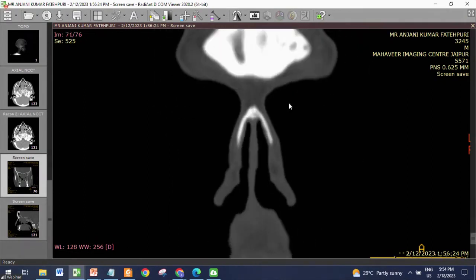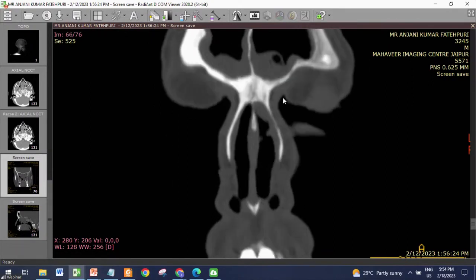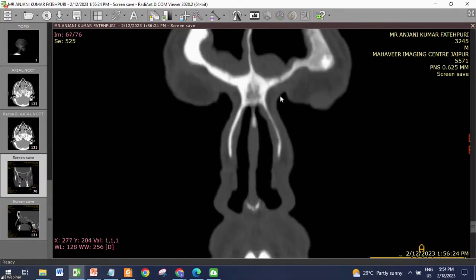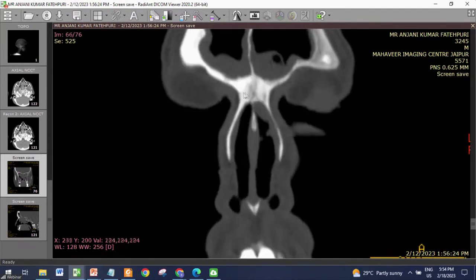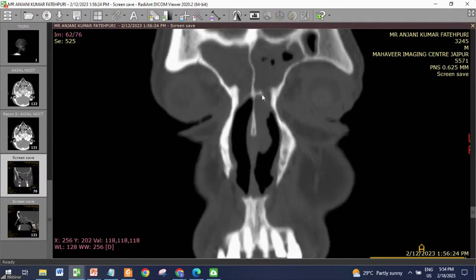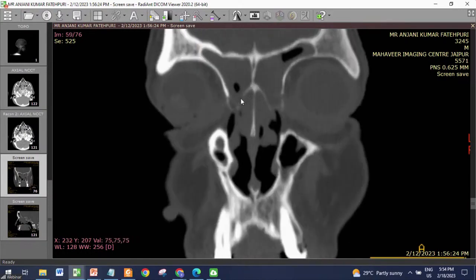See, this is anterior most. Now I am going posterior. First thing is the frontal sinus, anterior to posterior, and the floor is made by the beak. Now the beak has gone. This is how we open the frontal. Go along the beak, where the beak ends, behind the frontal. Can you see now? Yes, sir. That is the point. Now frontal has gone.